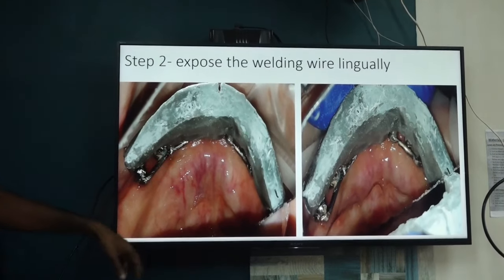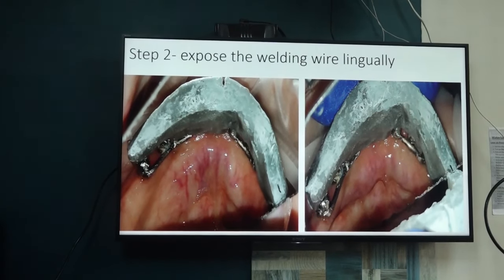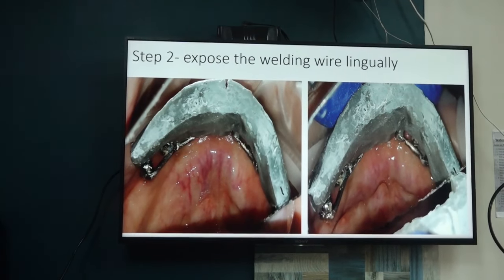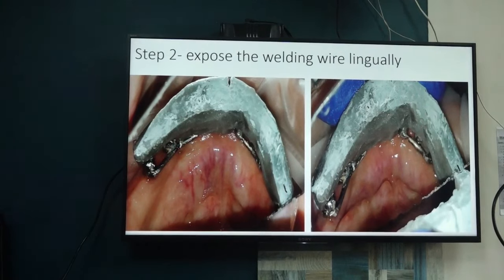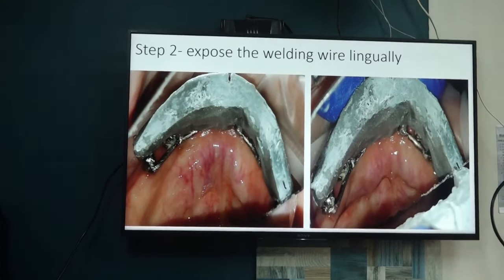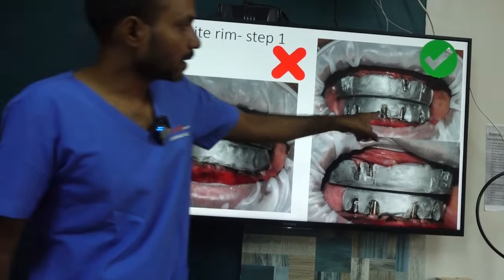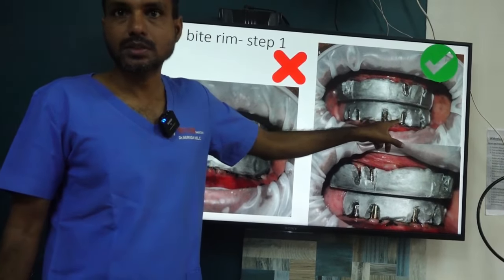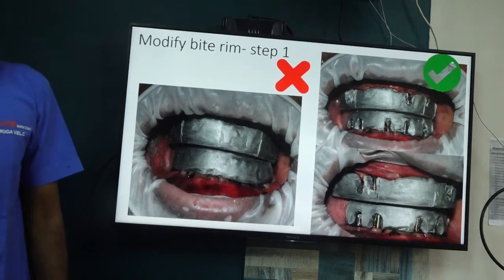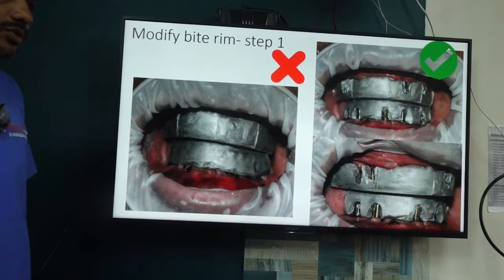What is the second modification? Second modification is to expose the welding wire lingually, as much as possible, but not in all situations. In which situations do you do this? When the implant is lingually placed and there is a buccal cantilever, then not always, or sometimes. Previous slide. See, when the implant is close to the labial aspect, you can expose this. Imagine sometimes the implant is too lingual. It is a class 2. You are putting more thickness here. You cannot expose, you have to dig so much. So, expose lingually.